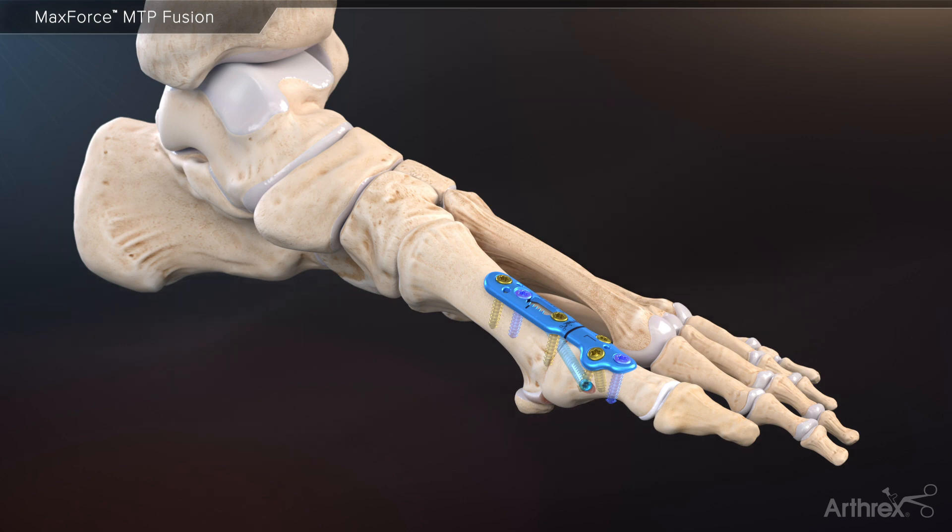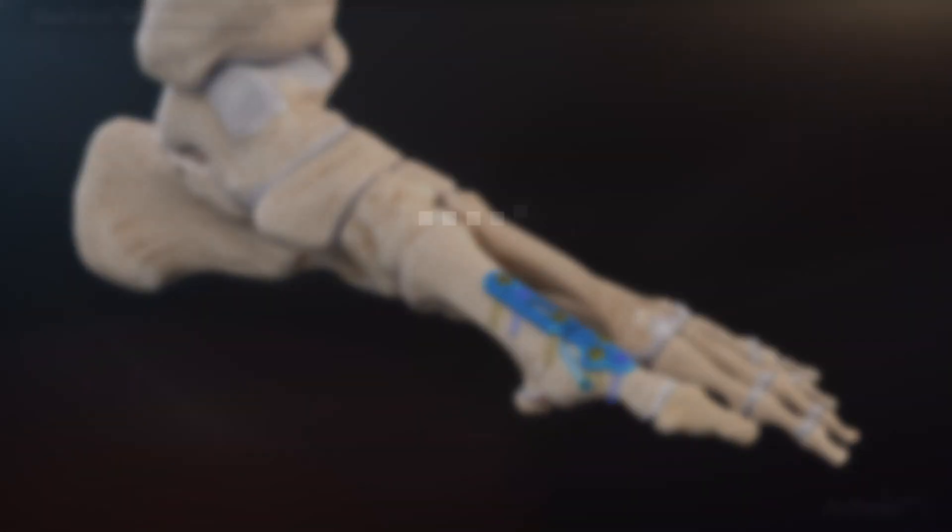Gear up for fusion with the MaxForce MTP plating system.